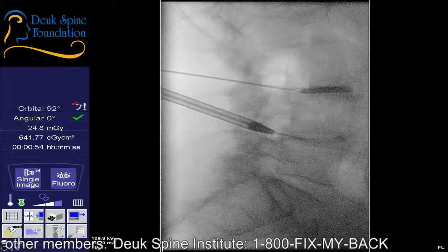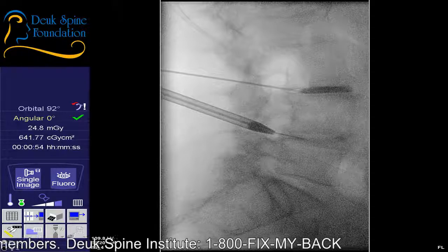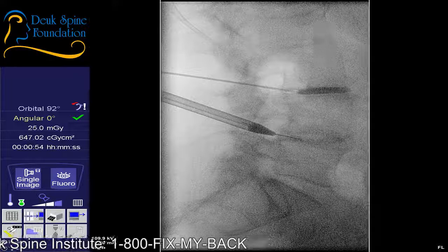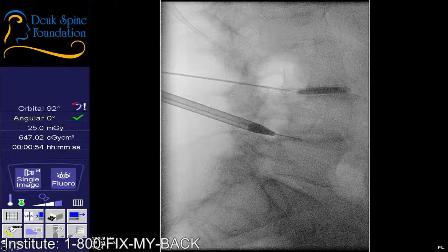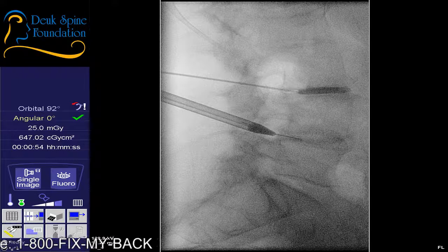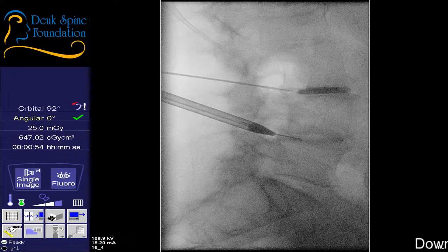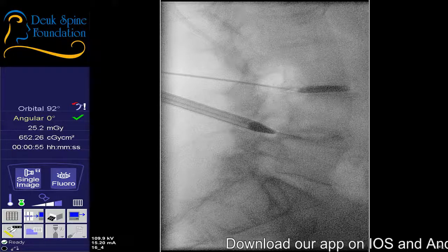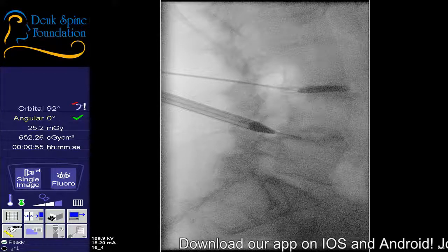So I'm going to do something that might surprise a few of you. I'm going to use a good old-fashioned hammer. Okay? I didn't buy this at the Home Depot. Nope. Instead, I paid about 1,000 times what a normal hammer would cost so I could have a special surgical hammer. But this hammer is going to be used to advance the dilator into the disc space.